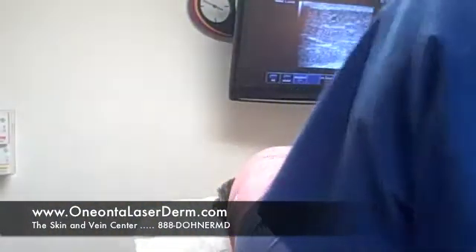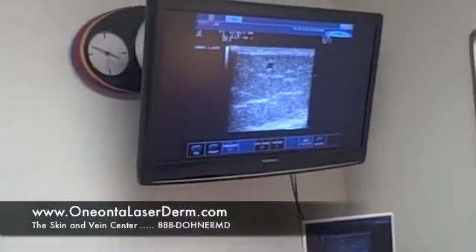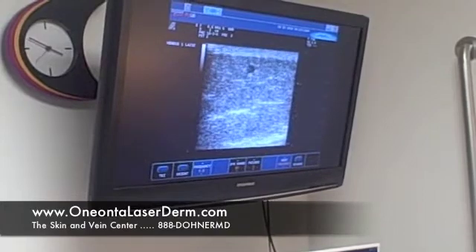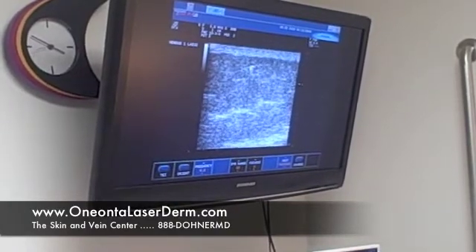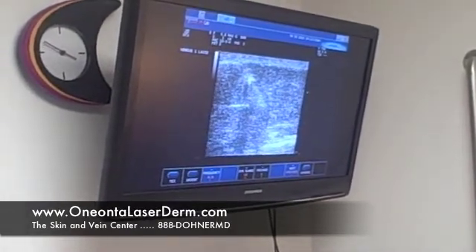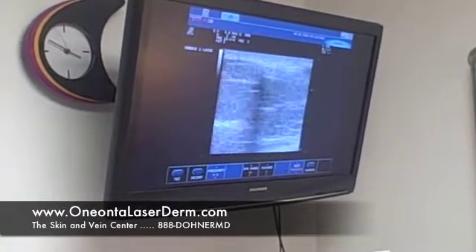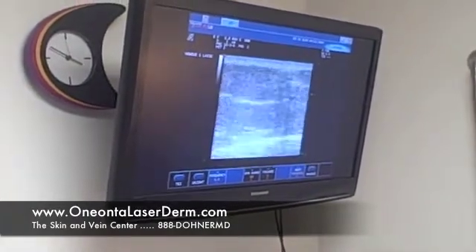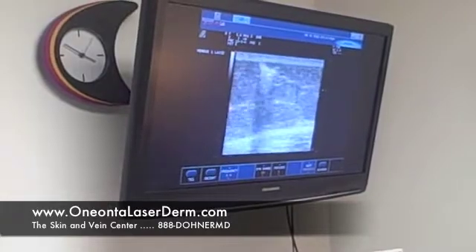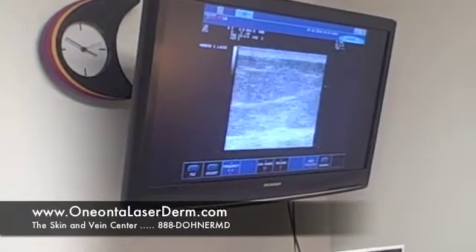I'm going to have to put my back to the camera. If the camera focuses on the ultrasound screen — I am now in the skin, right there. I got a flash, and now I've injected the medication. You can see the white on the video screen is the medication. You can see that medication has gone all the way around — we have treated that whole vein with a single shot. All the white on the screen is the foam; you can see it with ultrasound because it has air in it. That was a great injection.